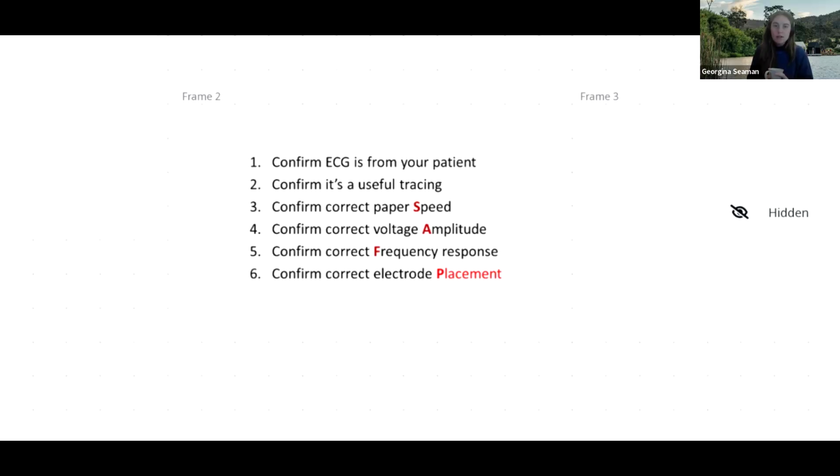There's a little thing on our ECGs to help us give a hint about how we look for this. It's written at the bottom or at the top of the ECG paper. Yeah, 100%. So your speed should be written at the bottom or the top of the ECG paper. And then Chloe said it should be a deflection mark on the trace. What does the deflection mark look like? Yeah, she's talking about the calibration thing. What will it look like and how big will it be?